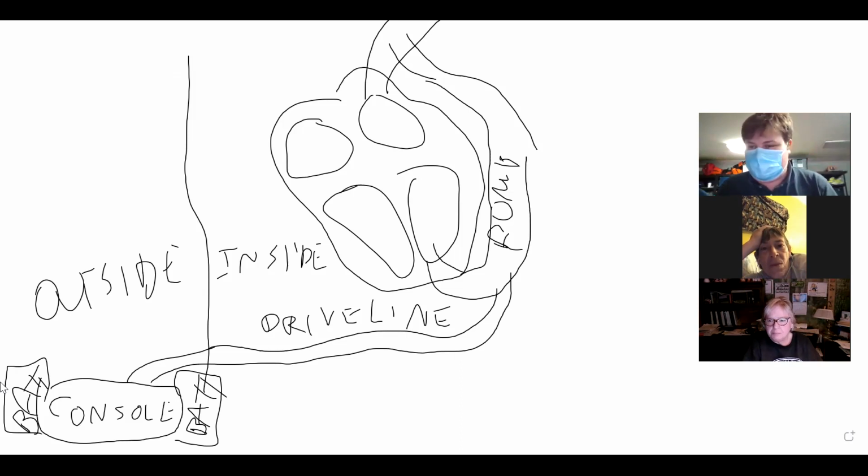The pump stops working. Now, in certain patients, it really depends on how much work the ventricular assist device is doing for the patient. If you were to pull both batteries out, you might see absolutely no change in the patient's condition. You might see some mild changes in their level of strength and respiratory effort.